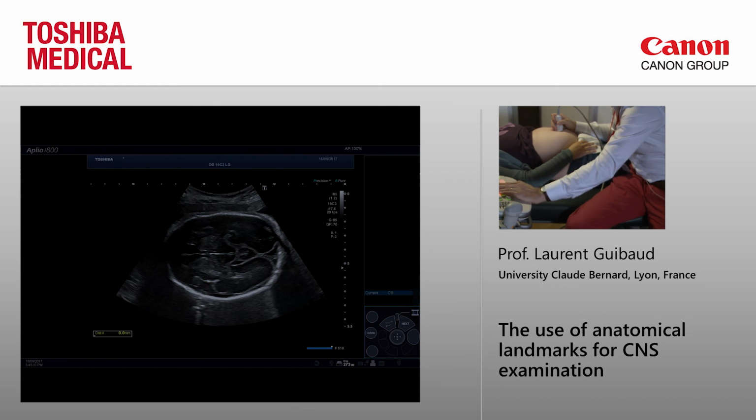This is the insula, middle of the insula. Here, all the way.